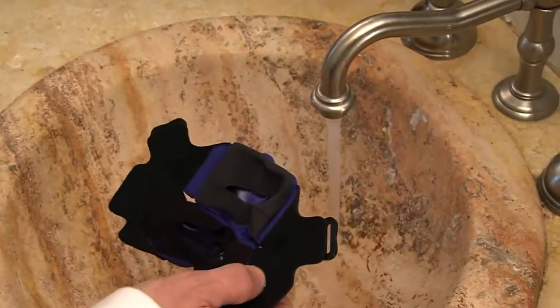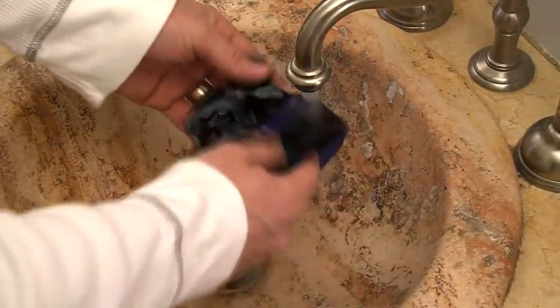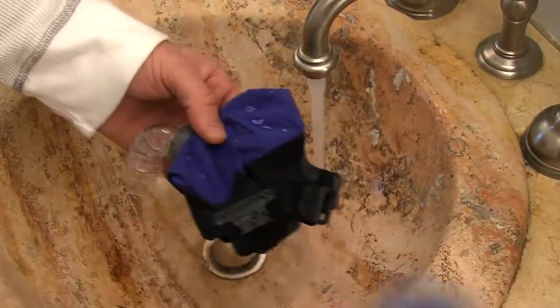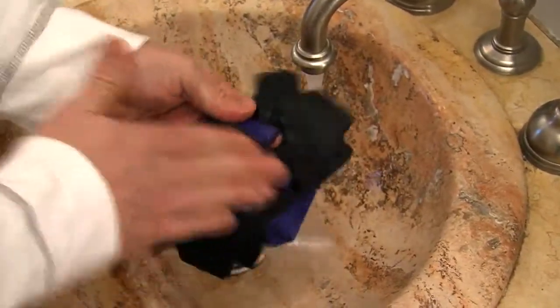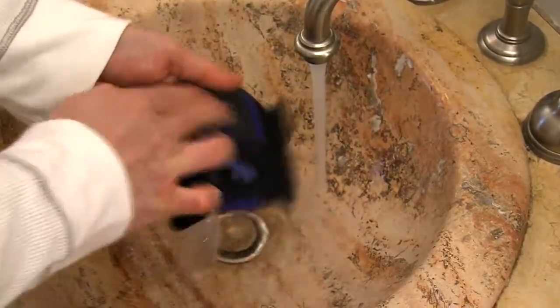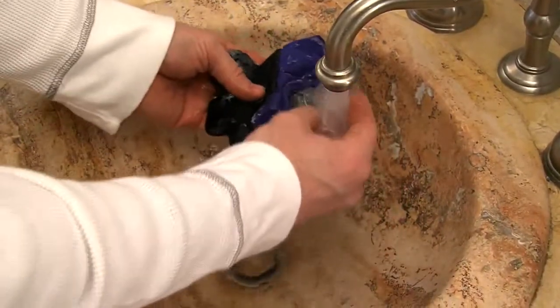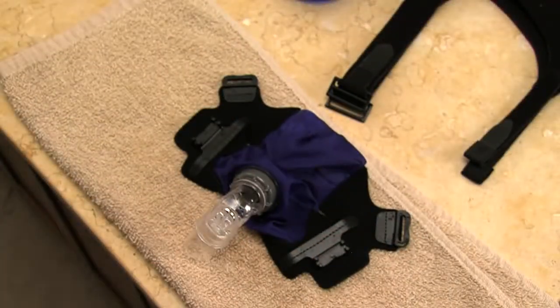It is recommended that your SleepWeaver Anew be cleaned by hand washing with a mild, non-abrasive soap in warm water after each use. Never use hot water. You may keep the 90-degree elbow AAV swivel attached during cleaning, or you may remove it and clean separately. Repeat washing until it is visibly clean. Rinse well with drinking quality water and allow to dry. Hand wash the headgear weekly.